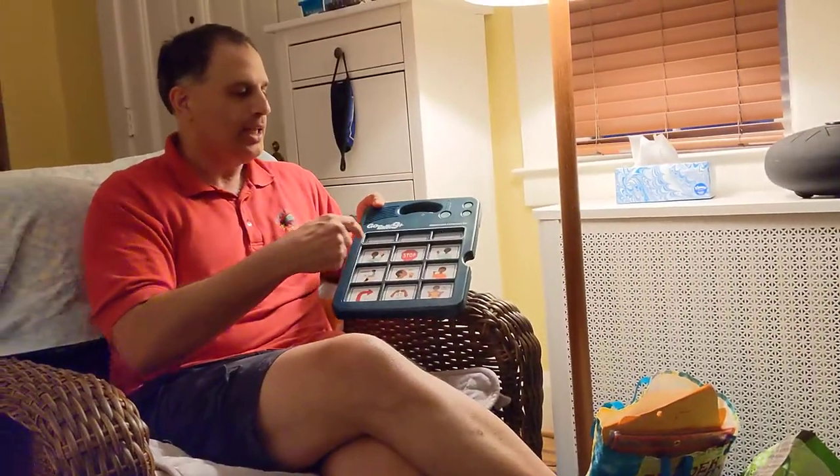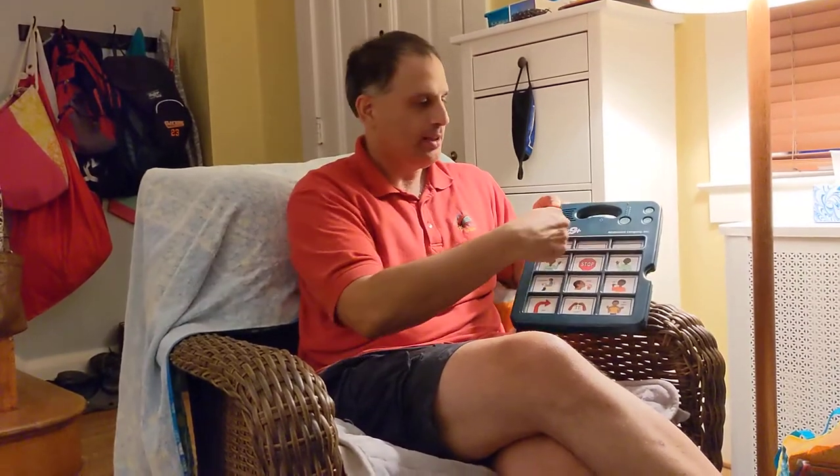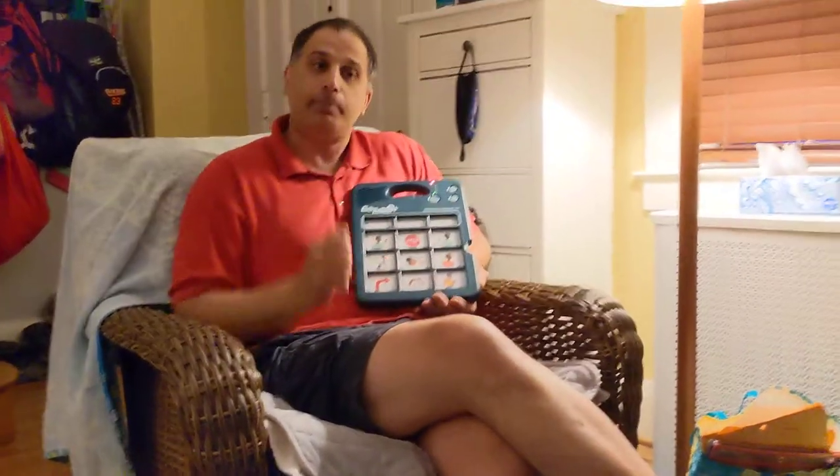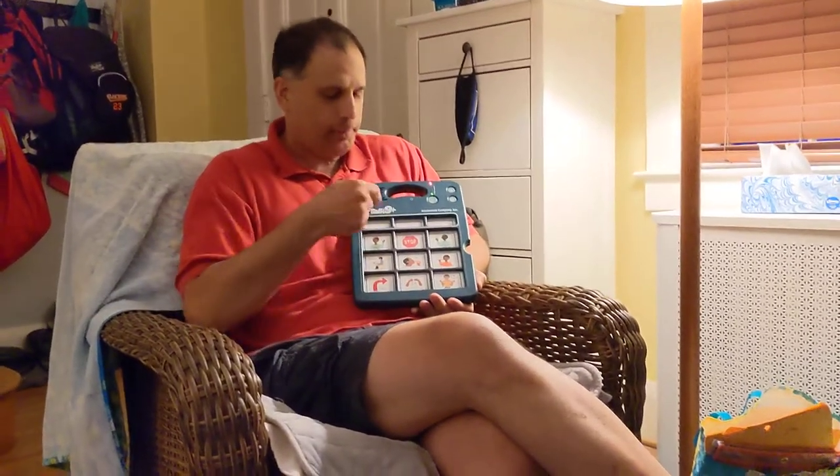For example, if I wanted to put a message in one of these top buttons — they don't have anything programmed at the moment — what I would do is press this record button on the back. Turn it back over, and you can see there's a red light on. Now, if I want to put a message in this button right here, I'm going to press it and release it, then speak my new message into the microphone, and then press this button again, and the message will be recorded.